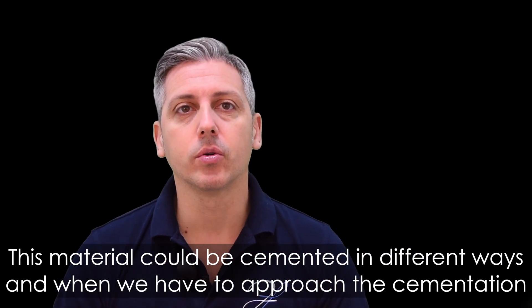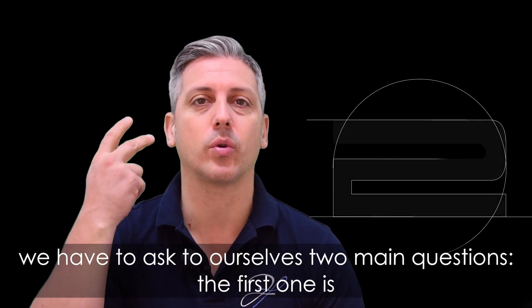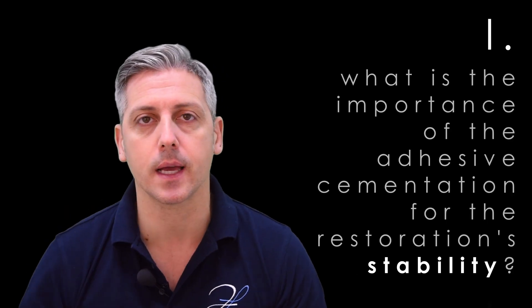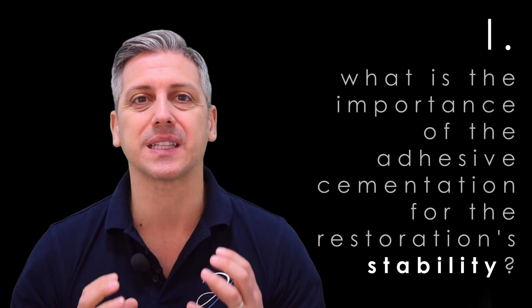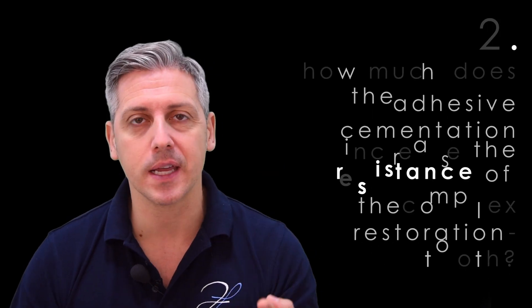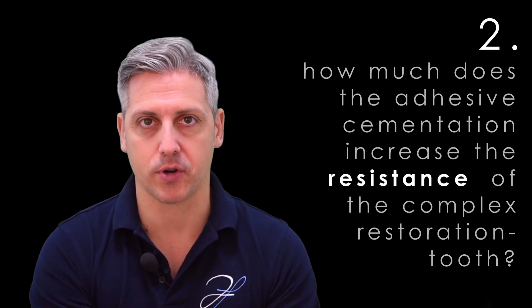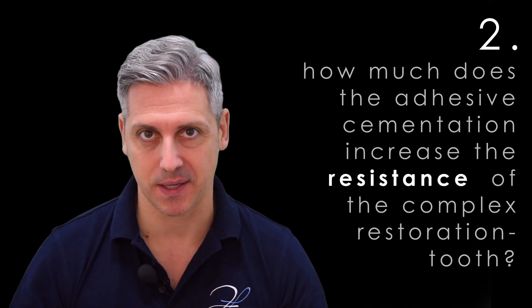This material can be cemented in different ways, and when we approach cementation, we have to ask ourselves two main questions. The first one is: what is the amount of stability that I need, considering the design of this restoration? The second one is: how much do I need to improve the strength of the complex tooth-restoration after cementation?